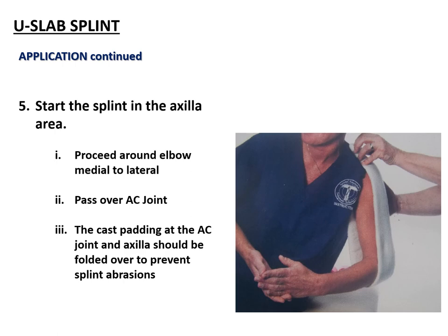Start putting the splint in the axilla — opposite to how it was measured — coming around the medial aspect of the elbow, over the lateral aspect, and up over the shoulder. It is often helpful to get assistance from the patient by having them lean slightly to one side, allowing the arm to hang like a pendulum, using gravity to help maintain the reduction. The patient is seen holding the injured hand with the good hand to stay in the anatomical position.